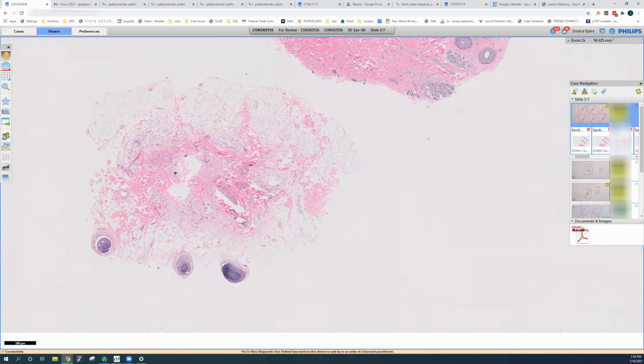So plasma cells are considered a normal component of inflammation in the scalp, and you can see them in lots of different dermatitis on the scalp. But this number of plasma cells is a little bit unusual, and for it to be a predominance of plasma cells is a little bit unusual. So this is a clue in this case to syphilis. It's not specific, but it is a clue.